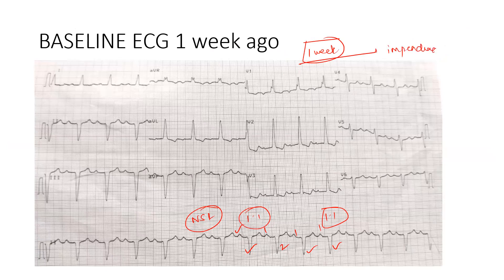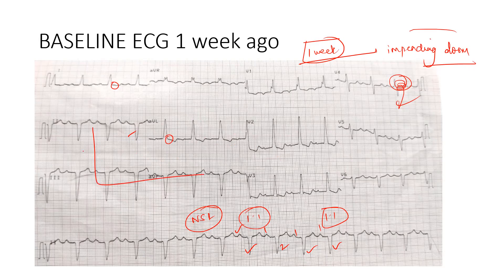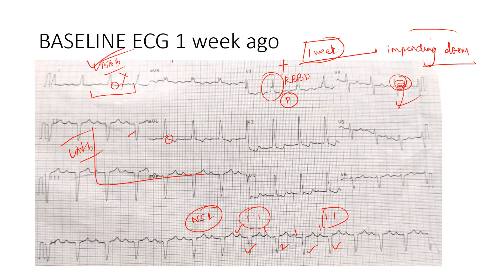There is no S wave in lead one and AVL again, and the criteria for left anterior fascicular block is present. In the pre-cordial leads, it appears like an RBBB, but in the limb leads it looks like an LBBB. A combination of LBBB morphology in limb leads and RBBB morphology in precordial leads is what is called masquerading bundle branch block. This is what our patient has.